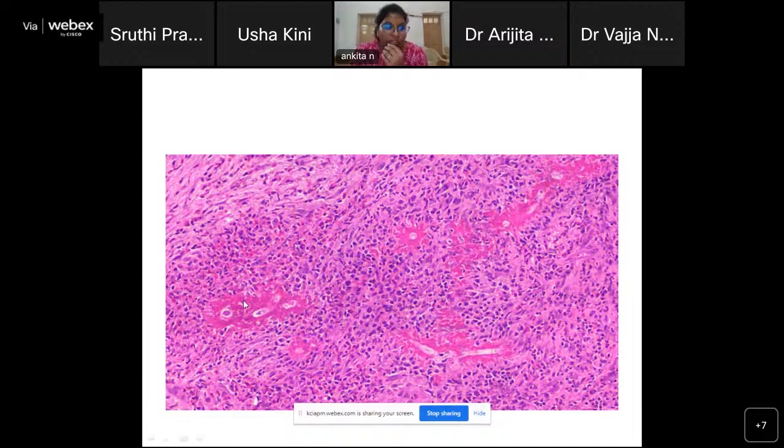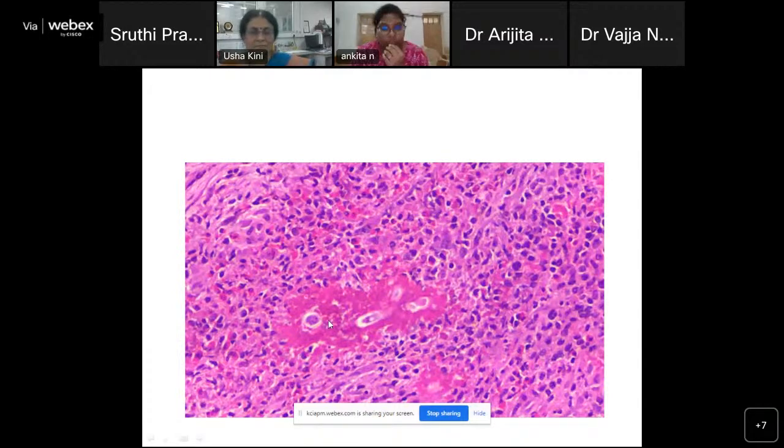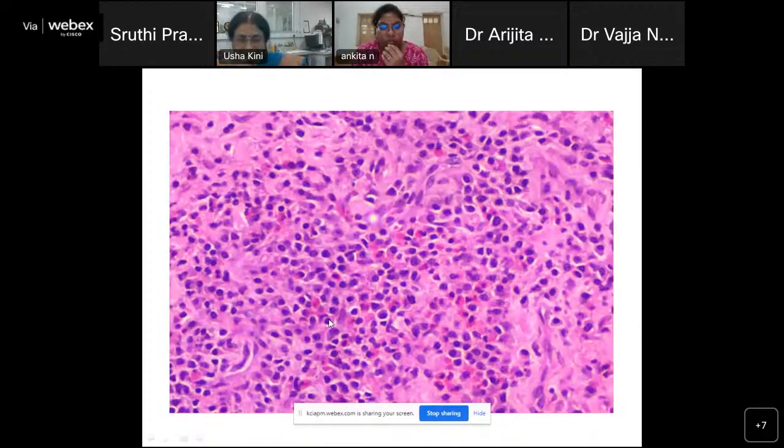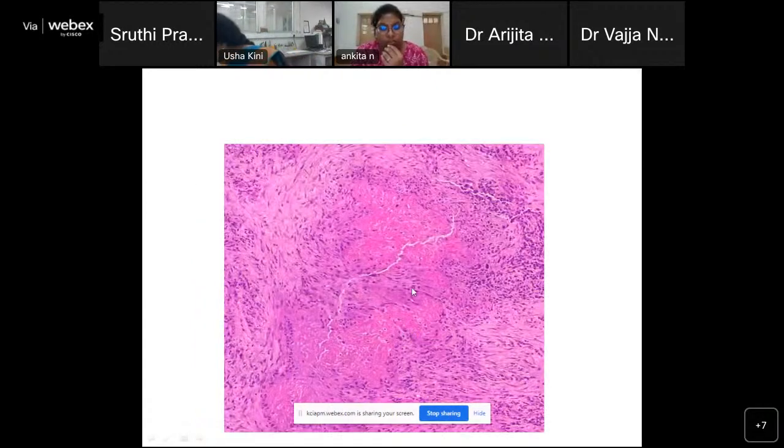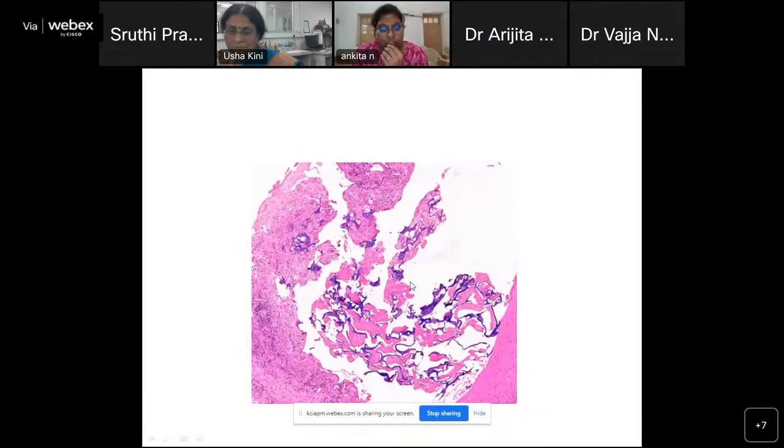Also, we are seeing here the blood vessels have undergone fibrinoid necrosis, and we see plenty of eosinophils and lymphocytes around them. This is another view of the same fibrinoid necrosis of the blood vessels. We also see a mixed inflammatory infiltrate, predominantly eosinophils, plasma cells, lymphocytes, and also neutrophils. There's also a focus where geographic necrosis was present, and an area that had cartilaginous and osteoid material.